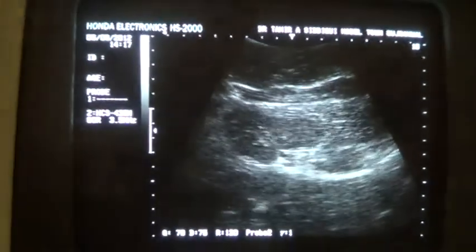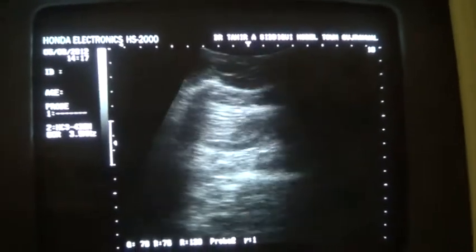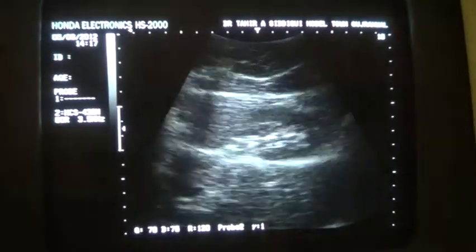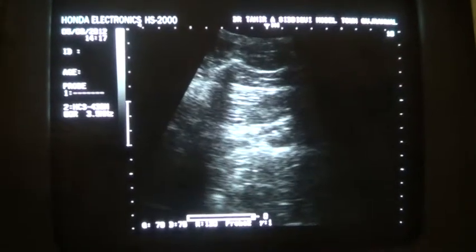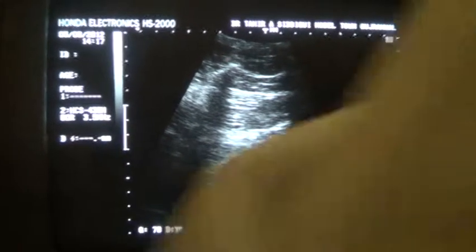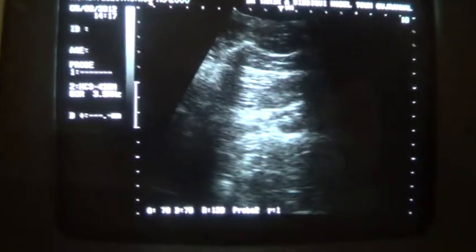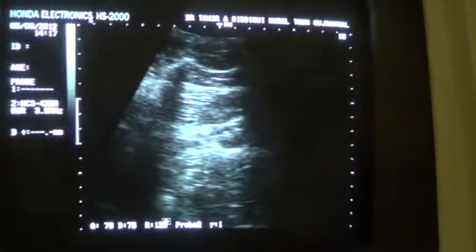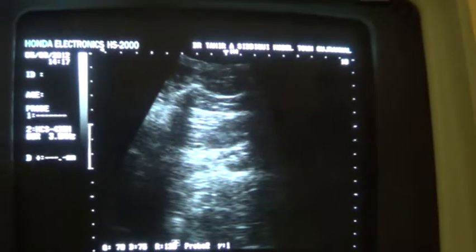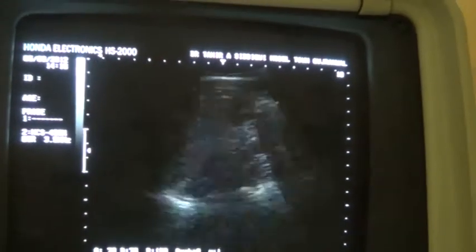Now the next kidney, the other kidney, I am getting straight away by placing the probe where I showed you. Now a 90-degree angle from this region, and here I get the hilar region. Now this approach is only in case the patient is thin and lean. In fatty patients, you may have to have a little different scanning plan. And if the liver is in line, you get the kidney more easily.